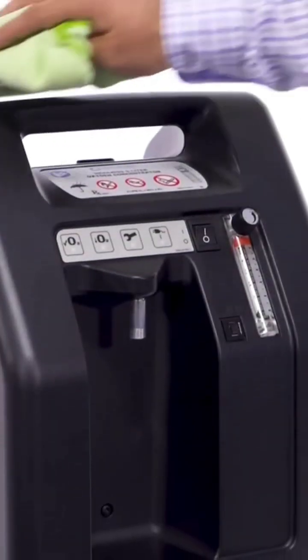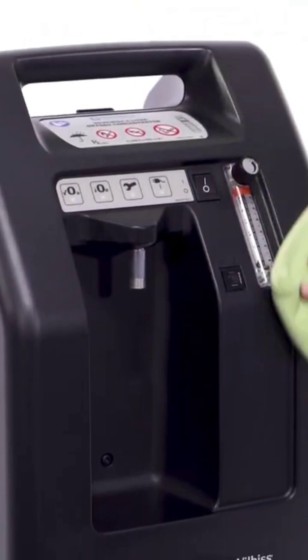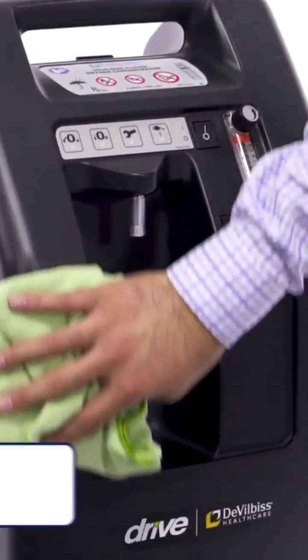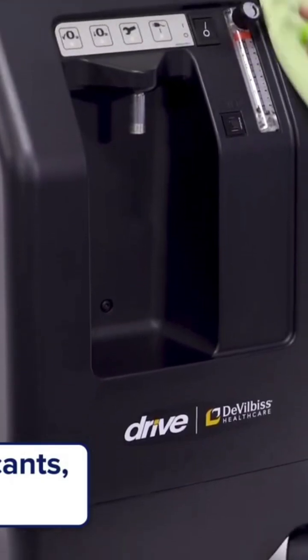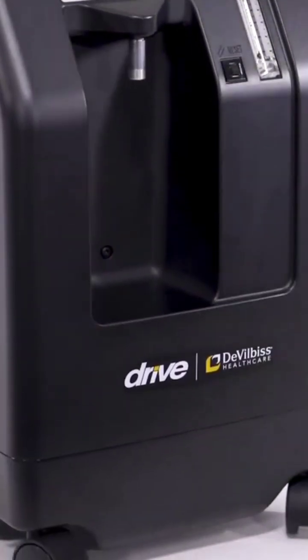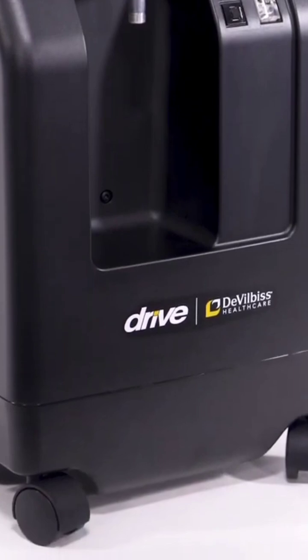Clean the concentrator exterior cabinet by using a damp cloth or sponge with a mild household cleaner and wipe it dry. All additional maintenance must be performed by an authorized Drive DeVilbiss service professional.